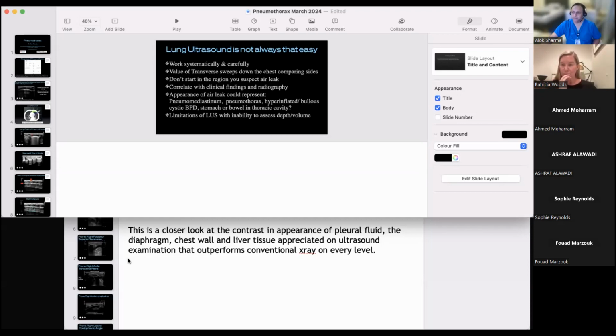Okay, thanks. The other question: sometimes there is a small rim in pneumothorax all over the lung. Is this an area that will be found in the images, in most of the imaged area, with no lung pulse, and the baby not suffering from any clinical symptom?